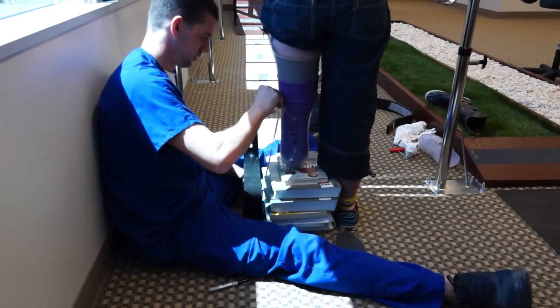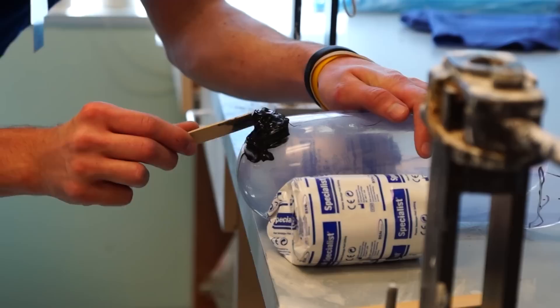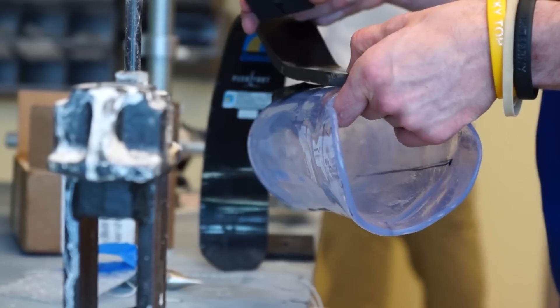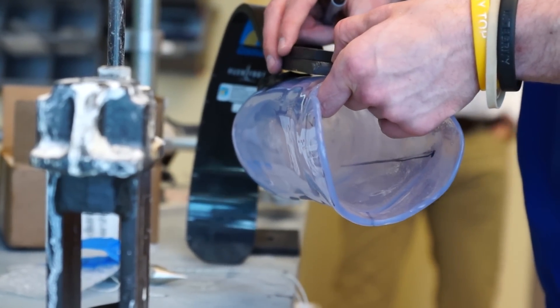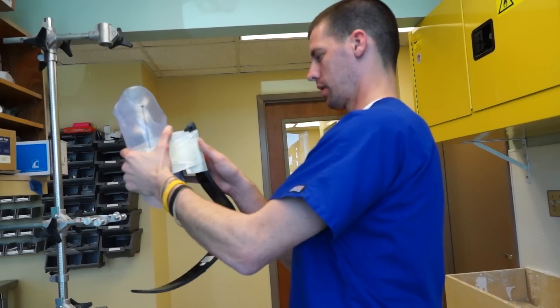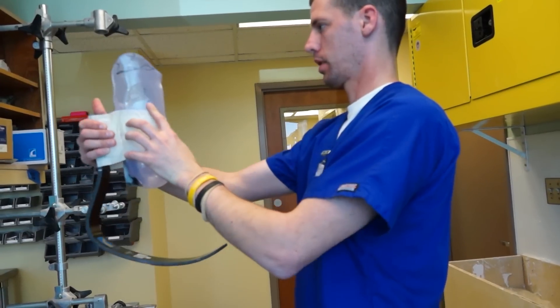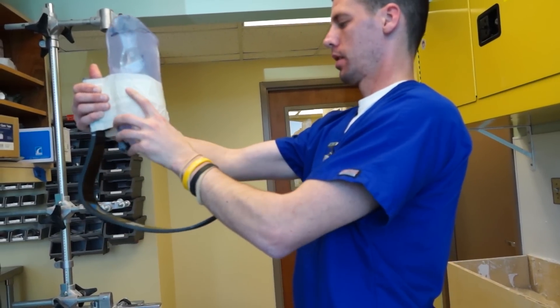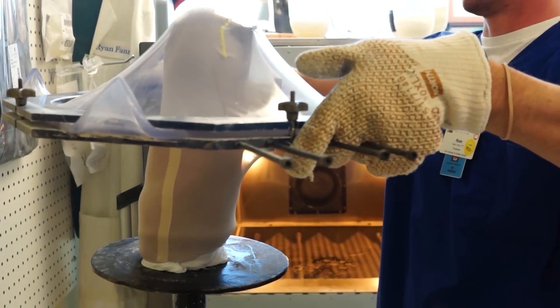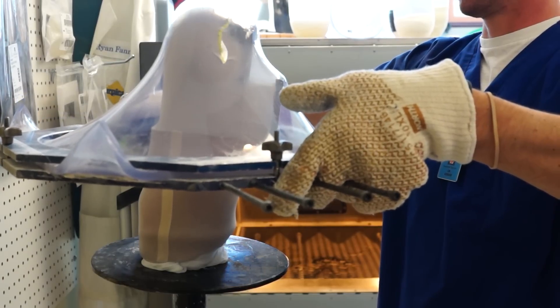Here Ryan is making measurements so he knows where to attach the blade to the back of my check socket. Because my running blade is mounted posteriorly, it's actually pretty difficult to adjust if you get it not quite right — it's not like you can just turn a screw to adjust the toe in or the toe out. So Ryan and Zach have come up with an inventive way of using basically a double socket in order to make a test prototype for my running leg.